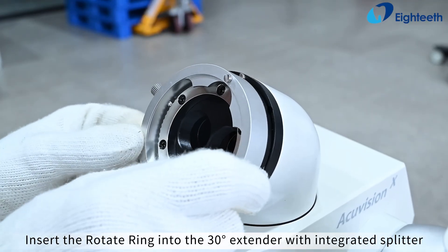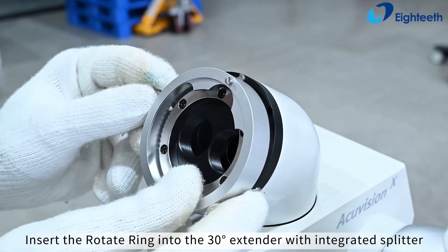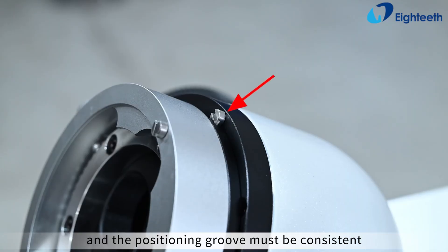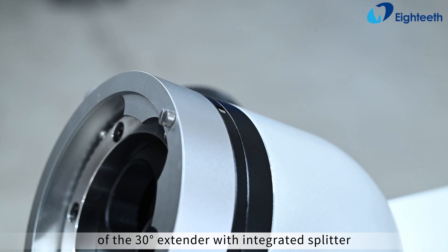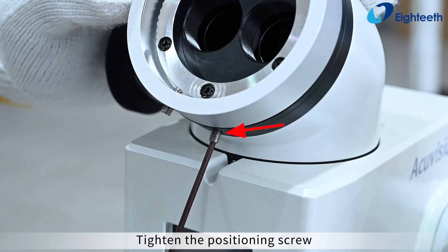Insert the rotate ring into the 30-degree extender with integrated splitter. The positioning groove must be consistent with the positioning pin of the corresponding interface of the 30-degree extender with integrated splitter. Tighten the positioning screw.